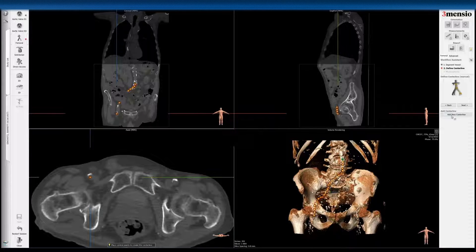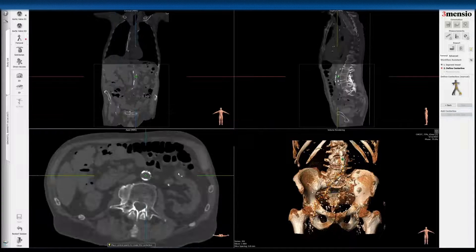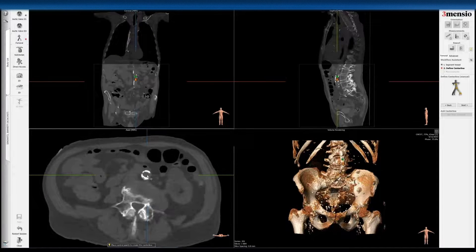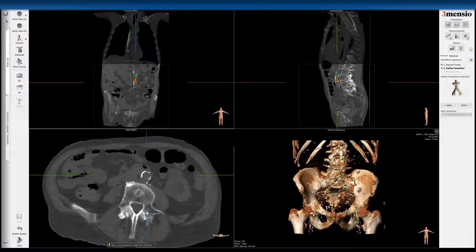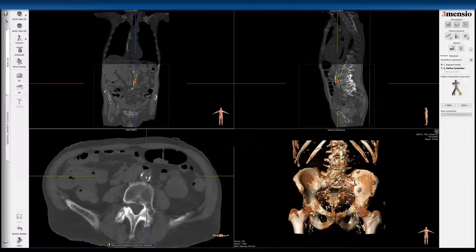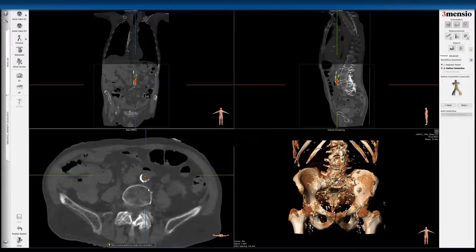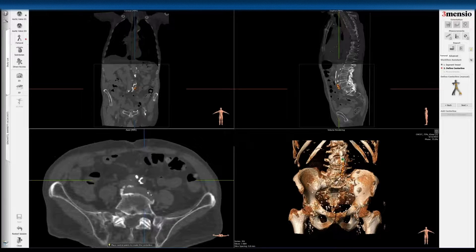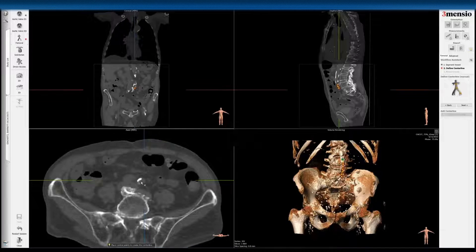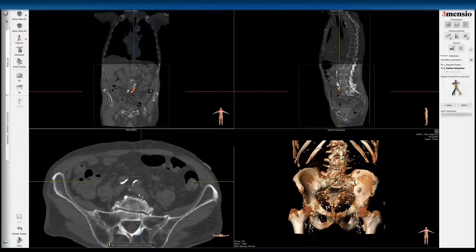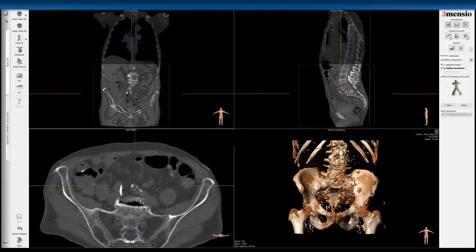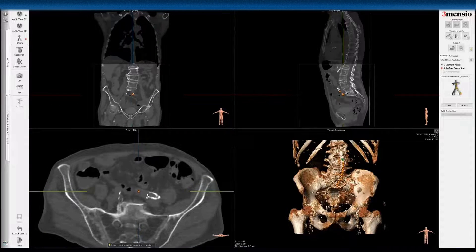So after you've done that, you go to 'add new centerline' on the right side. You now do the same thing for the left iliofemoral system. You can just trace along — it's actually relatively straightforward. You can see that here.